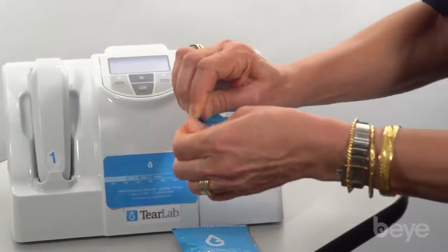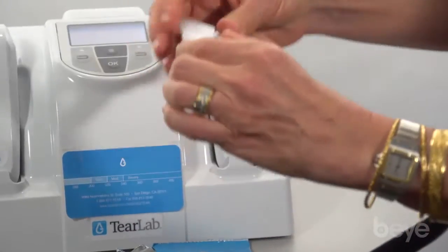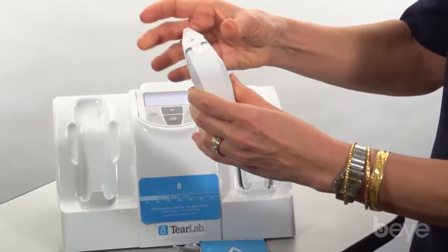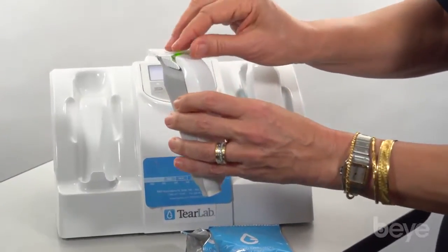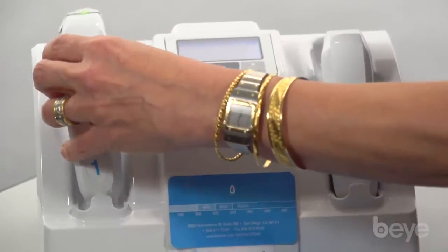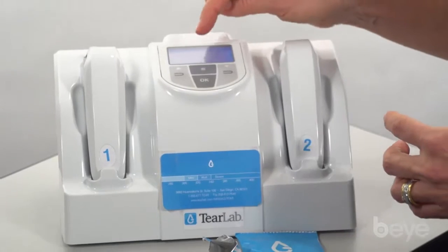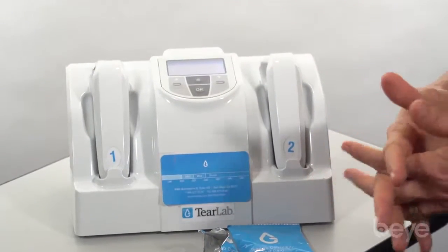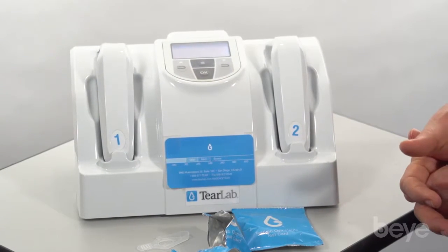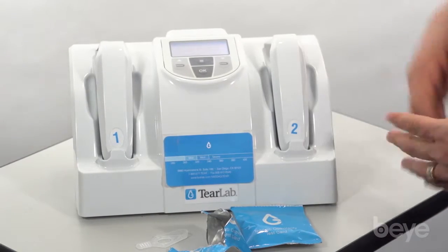The test cards come in individual foil pouches. Basically, you have to open the pouch, get the test card out, and you use one test card per eye per patient. The tip gets mounted on the handpiece and it clicks in. When the light turns green, you take the cap off. This is disposable. And then you put it back into the handpiece and hit OK. And you verify that the handpiece and the number are the same. And then within seconds, the tear osmolarity number is visible to the technician, which is then recorded in the patient's chart. Then you do the same exact thing for the second eye.